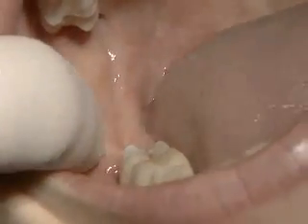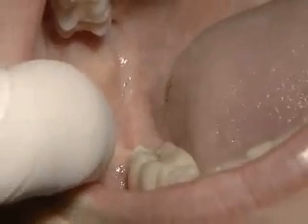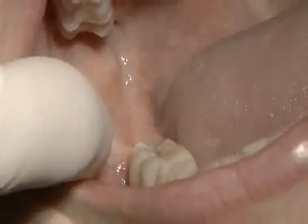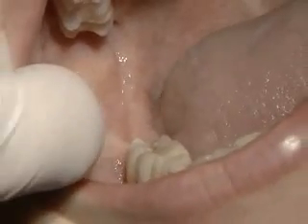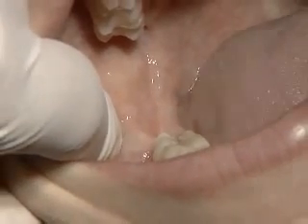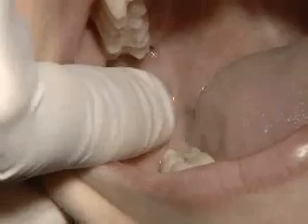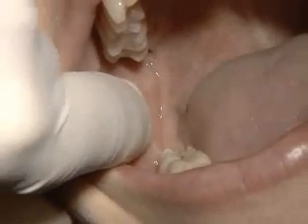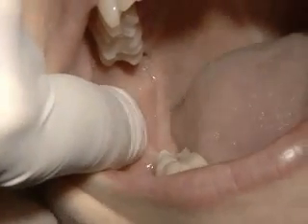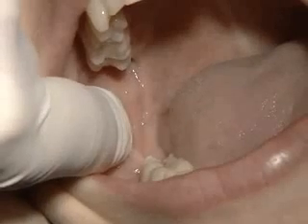The patient needs to open her mouth wide, and the first point palpated is the anterior border of the ramus — specifically the coronoid notch of the external oblique ridge — where my finger is resting right now. You then move your finger in medially to feel the internal oblique ridge, which marks an important landmark because it is just medial to this point where the needle will be inserted.